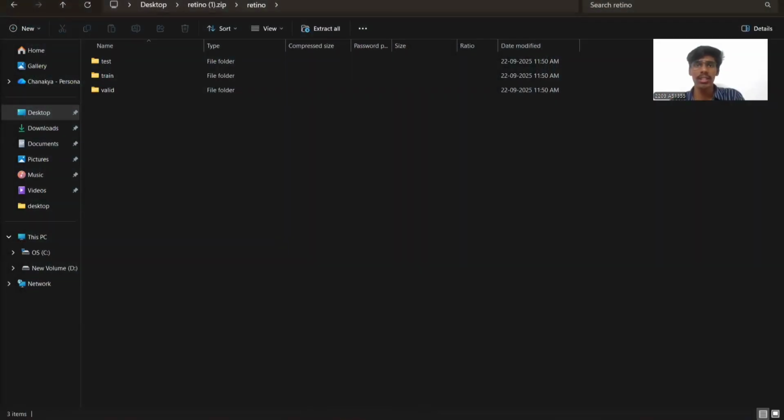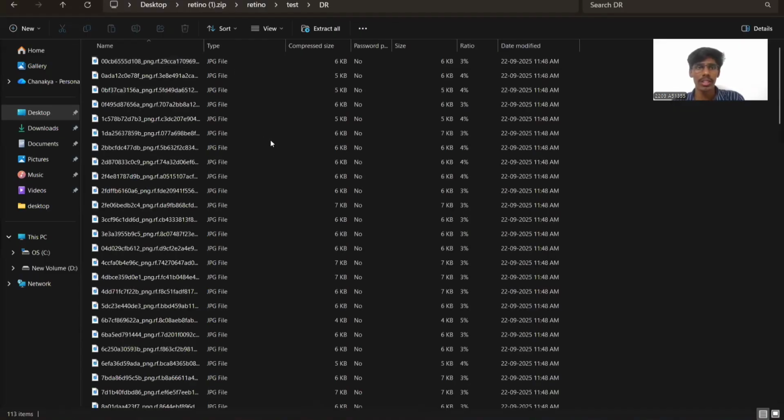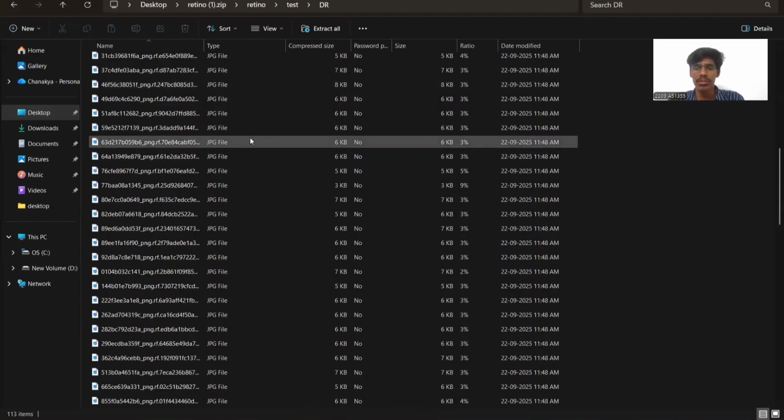This is K. Chanakya. I'm here to explain the basic technical information about my dataset and my code. So we have used the FIVES dataset. Here, these are the images we have inserted in my dataset. It contains retinal fundus images and is used for blood vessel segmentation.